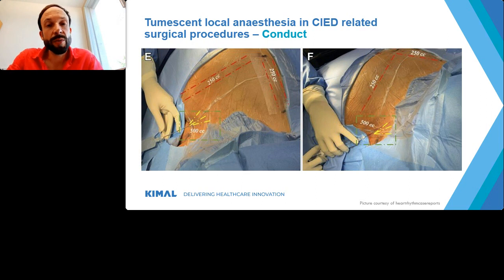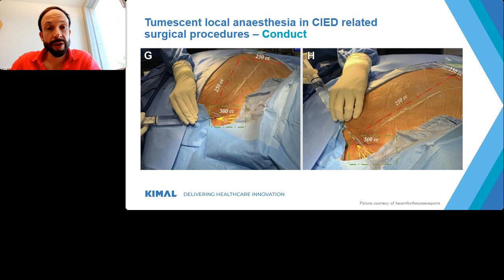And here's the picture of the 500 cc infiltration with local anesthetics in the pocket area, in the mid-axillary line of this patient. Okay, a lot of pictures here.